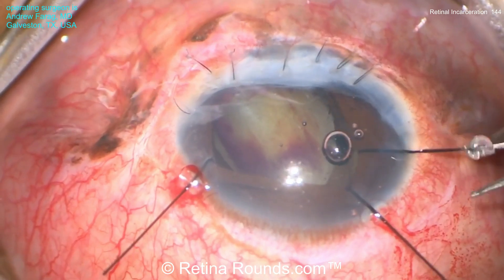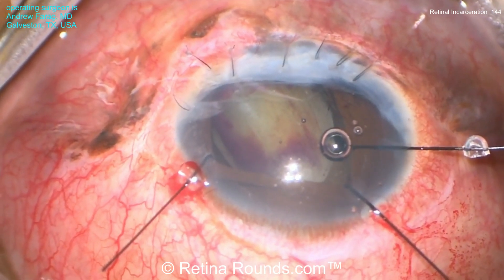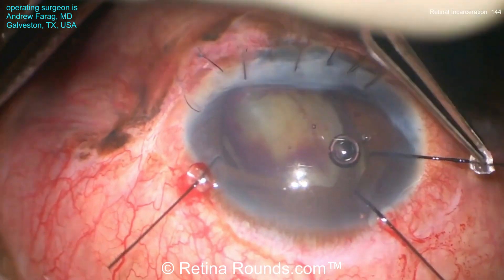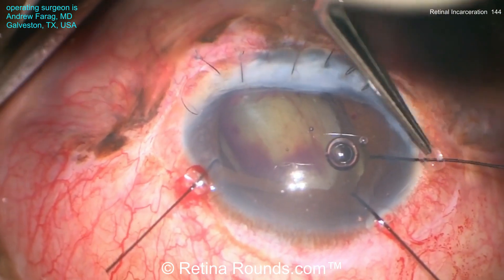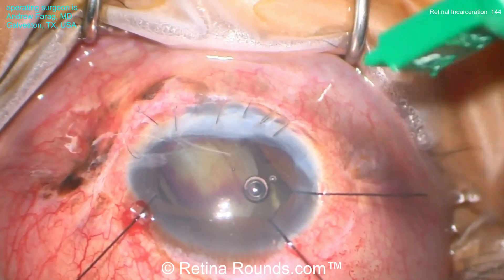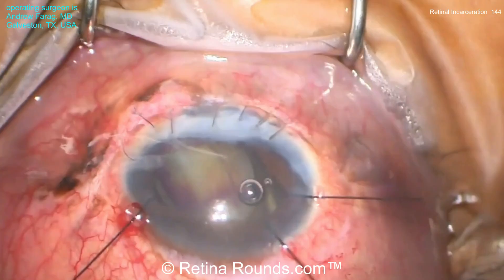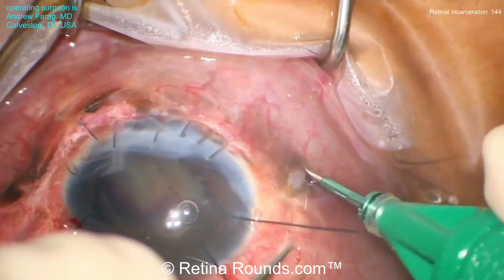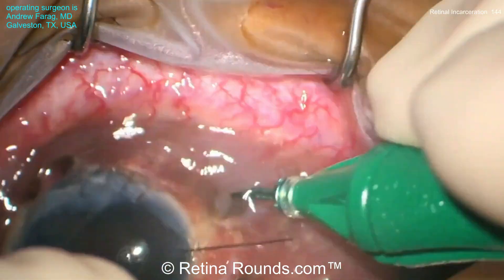That last iris retractor is going in, and now you can see the subluxated crystalline lens. Placing the iris retractors is a really important step to get good visualization of the posterior segment.